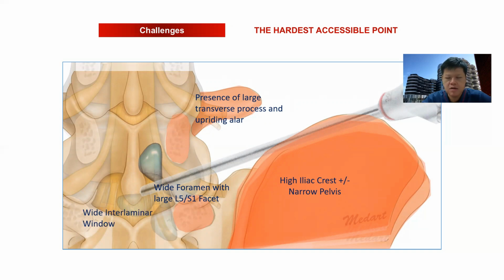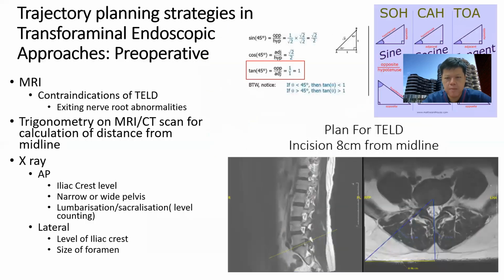We may consider using the interlaminar approach for central and paracentral disc or upward migrating disc, since it has a wide interlaminar window where we can explore. However, our topic today is on transforaminal endoscopic surgery, hence my focus will be on talking about that.